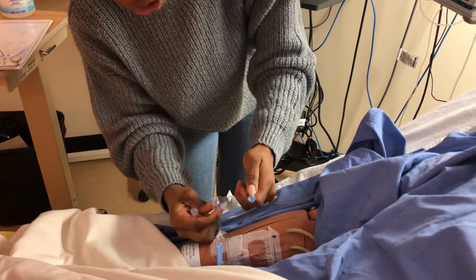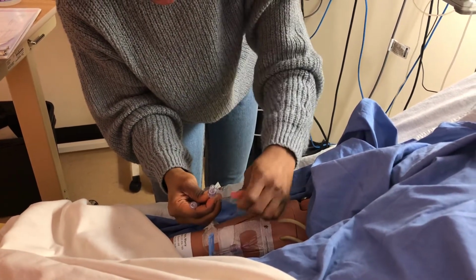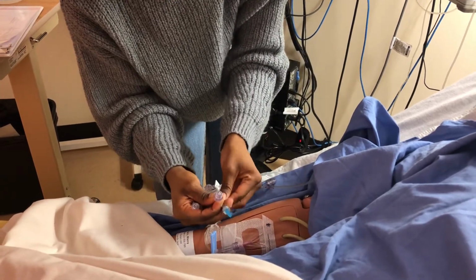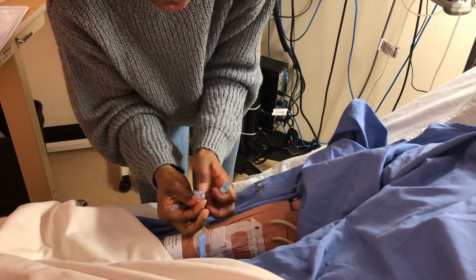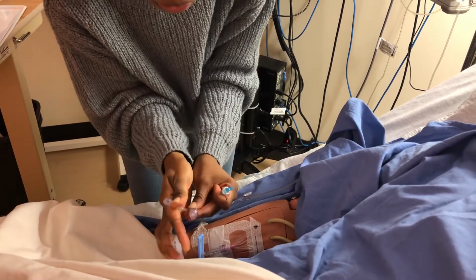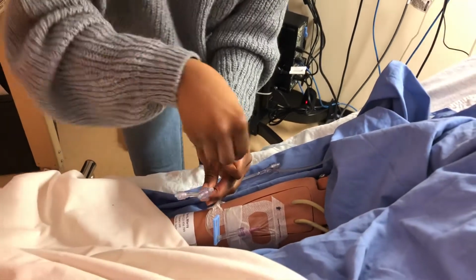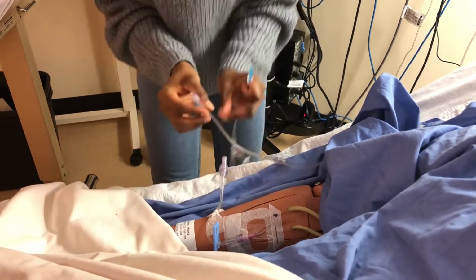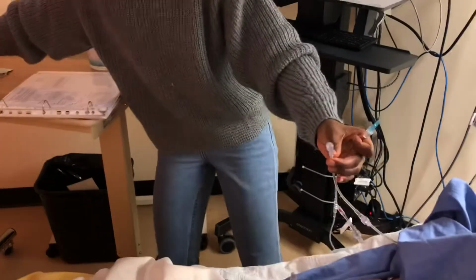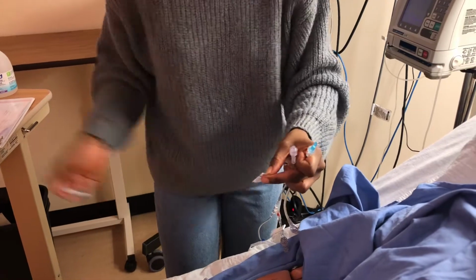Okay, ensure to maintain sterility. And try not to touch the tip of anything here. So I'm gonna leave that first, and I'll cover that with a cap, just so I don't touch it.